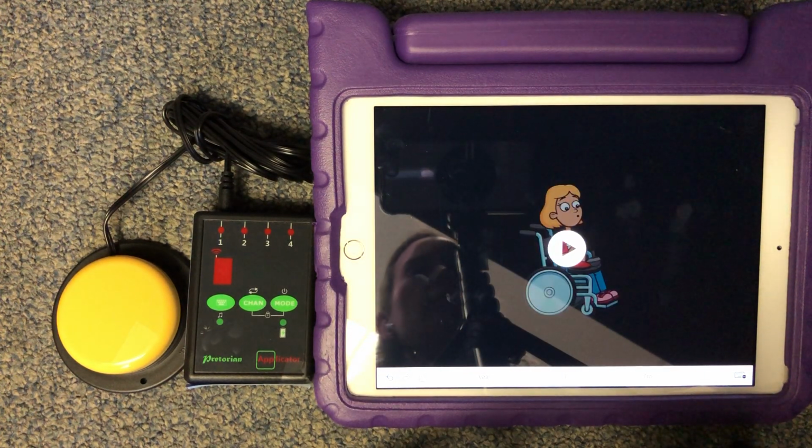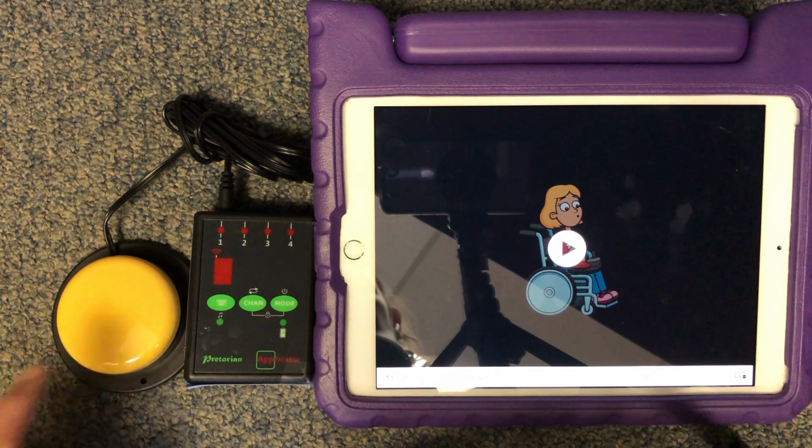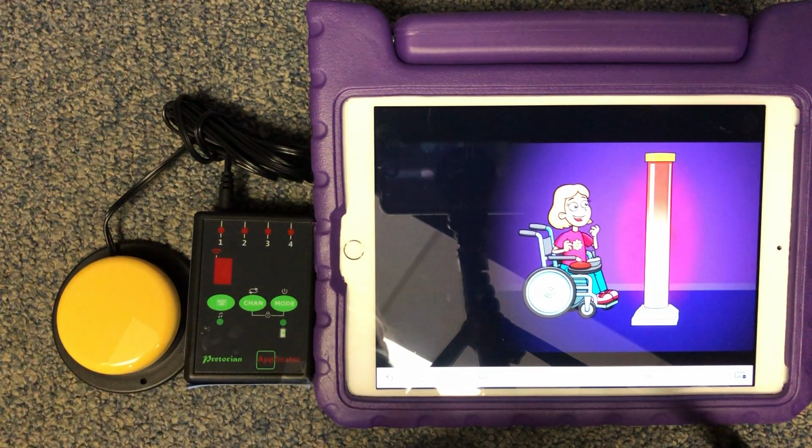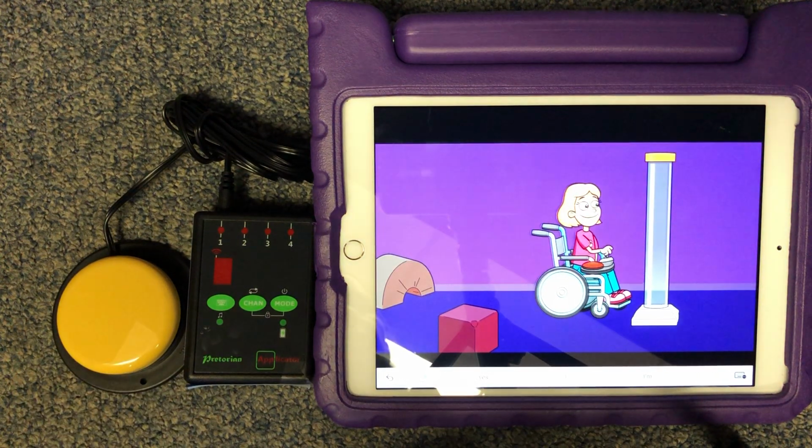So there are apps out there that have been designed for switch access, and you can always look those up. But in addition, let me just show you what else happens. Right, and then you can keep going and it will tell the whole story.